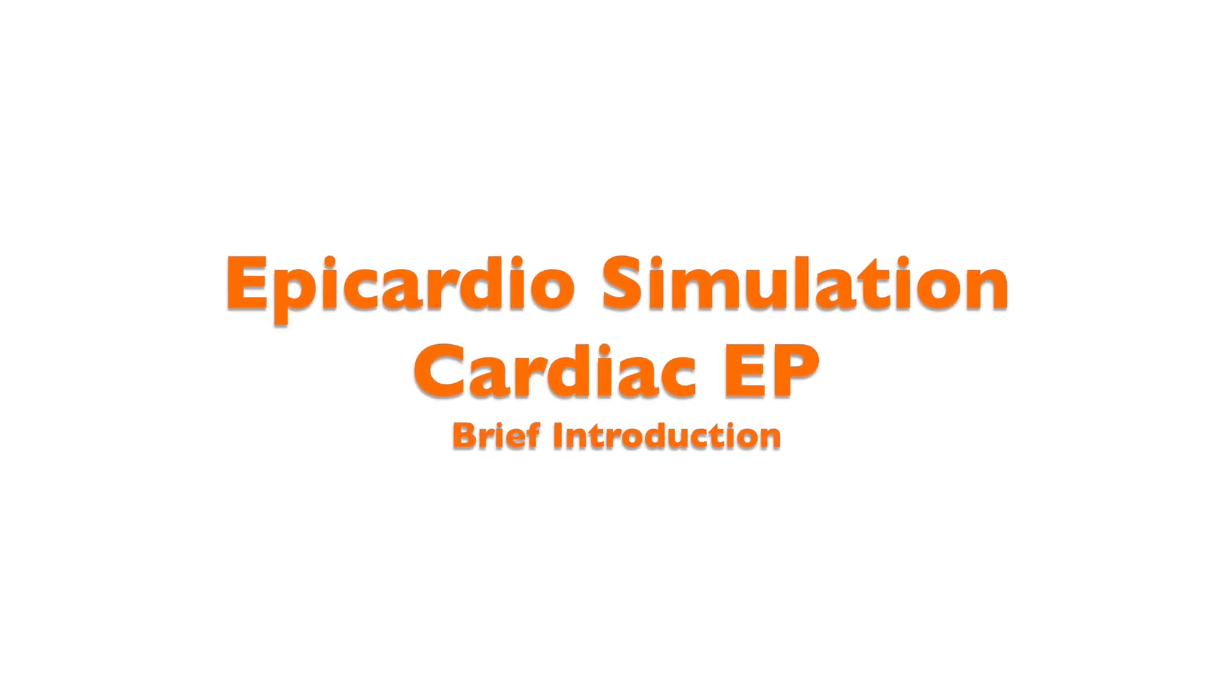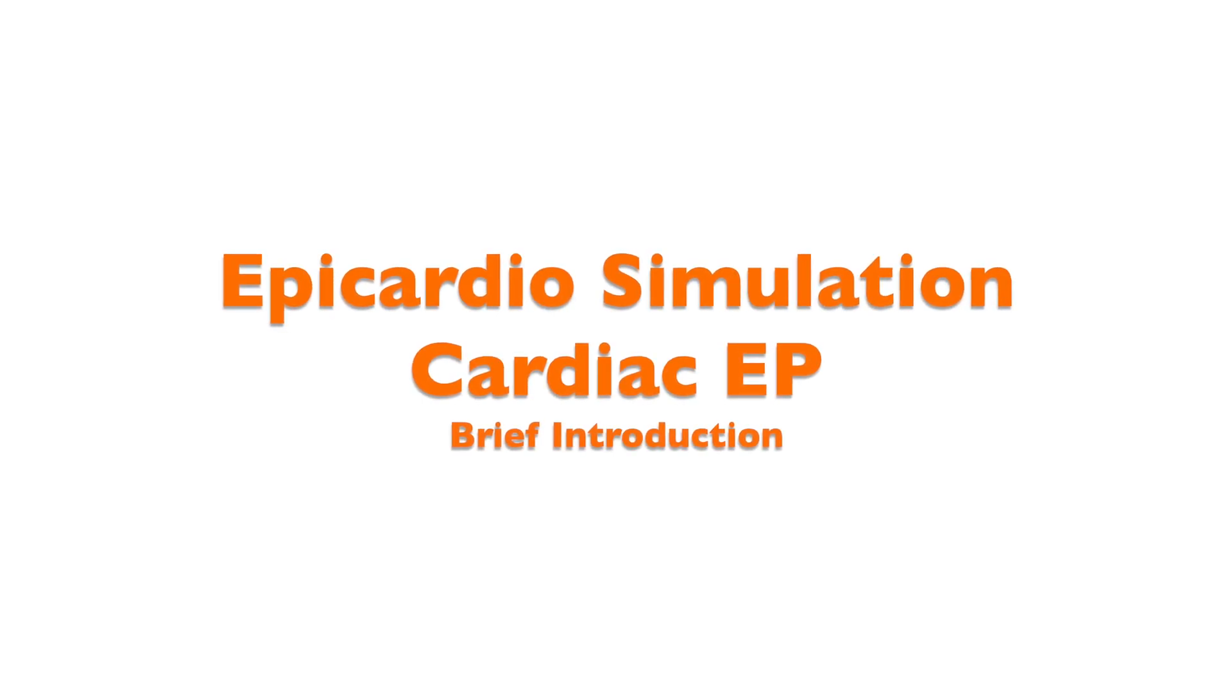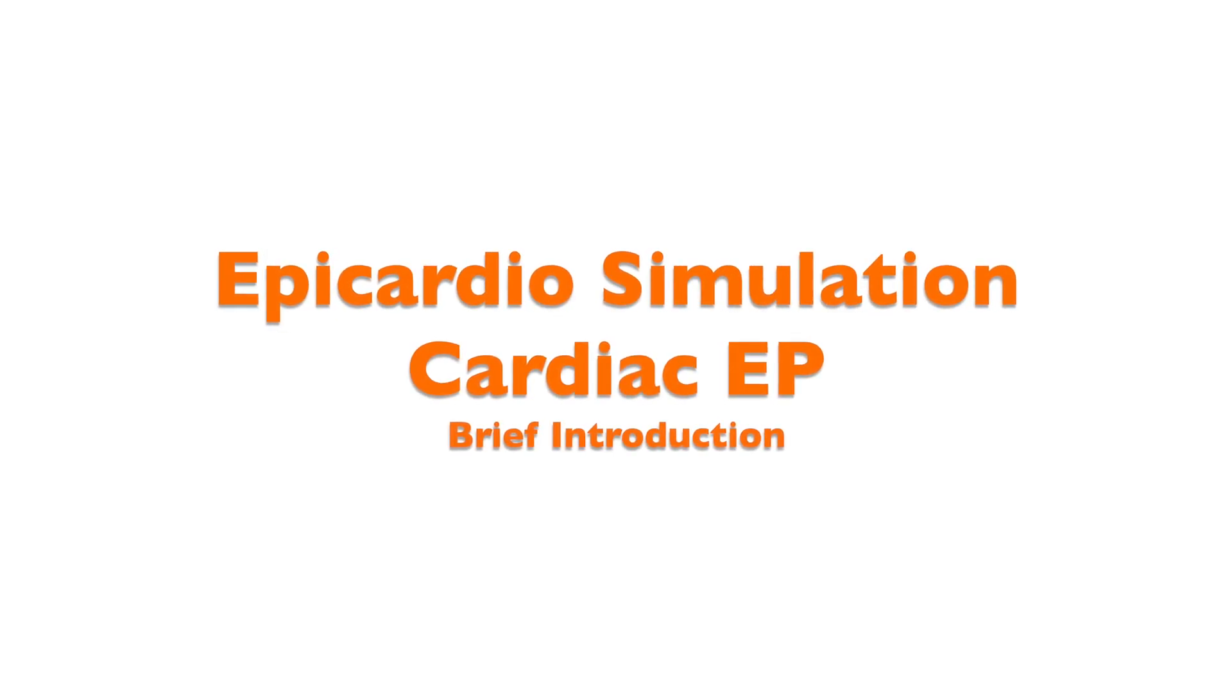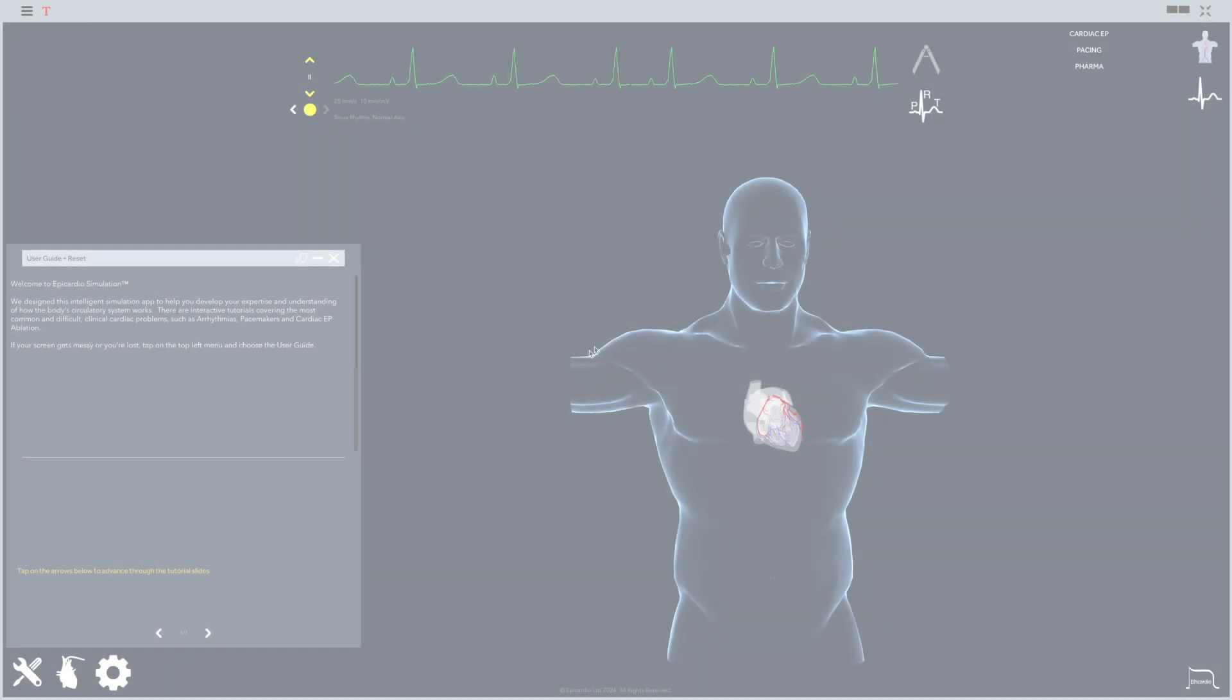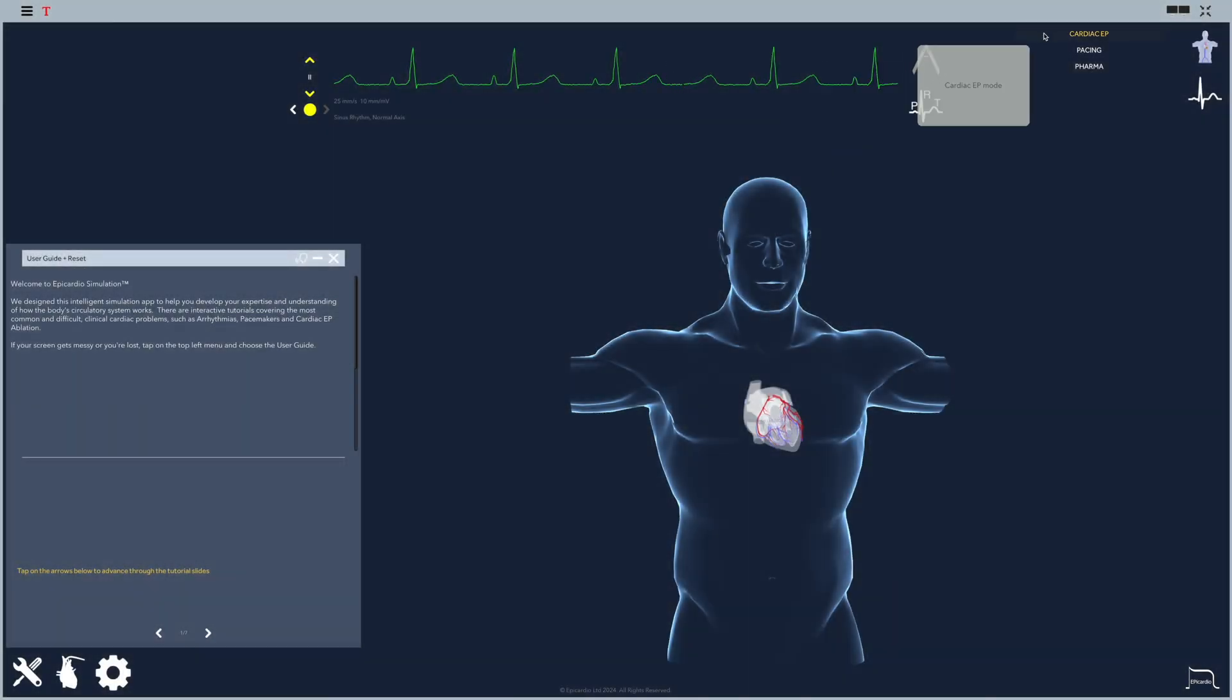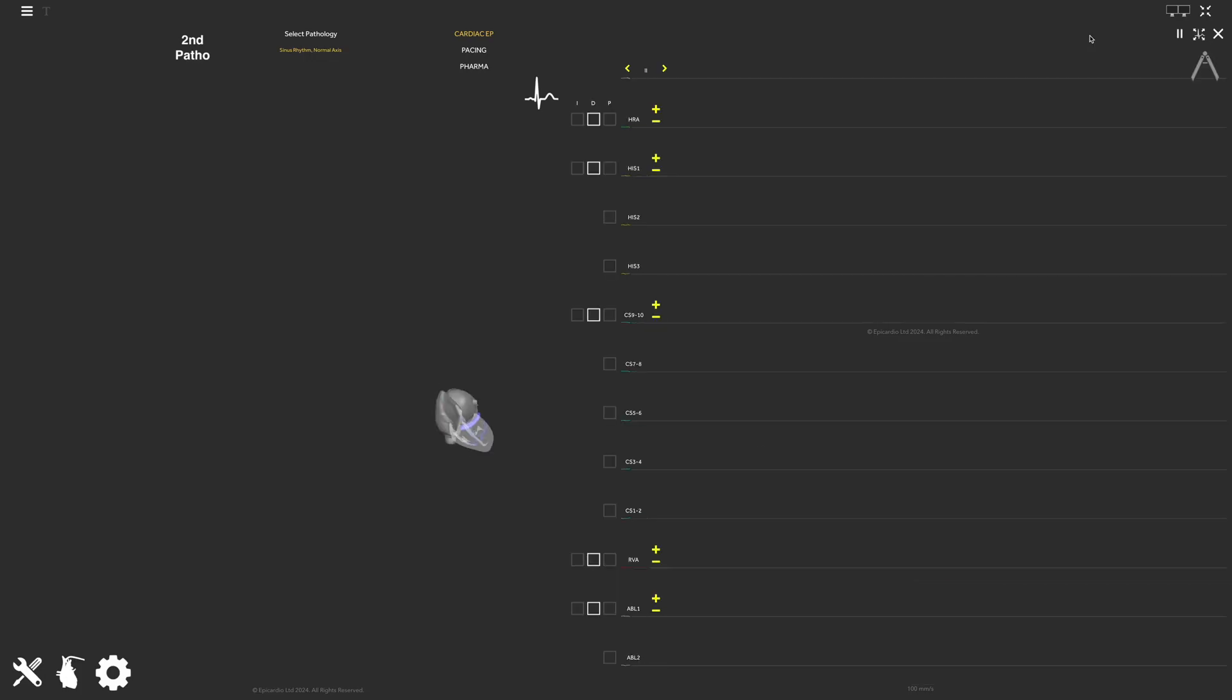Welcome to EpiCardio Simulation Cardiac EP: Brief Introduction. After your login, click on Cardiac EP to enter.